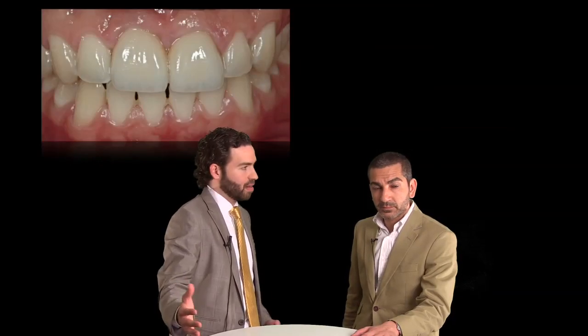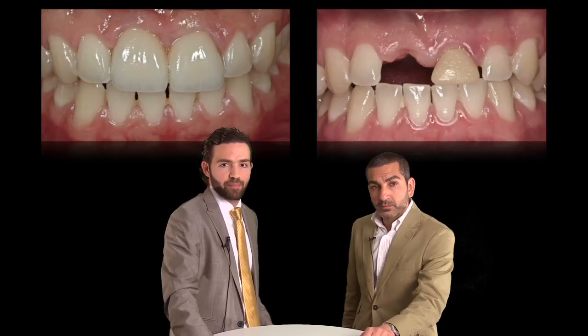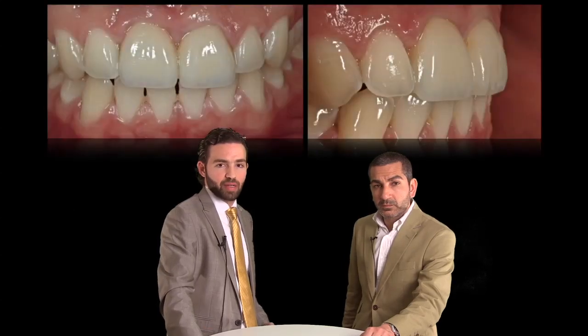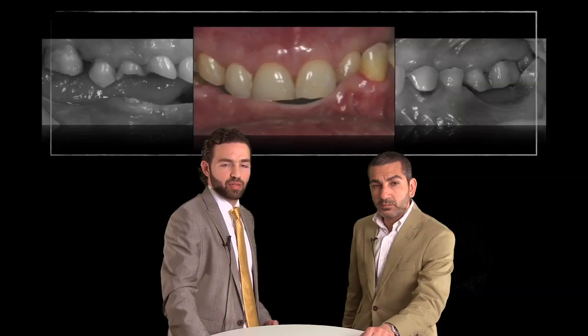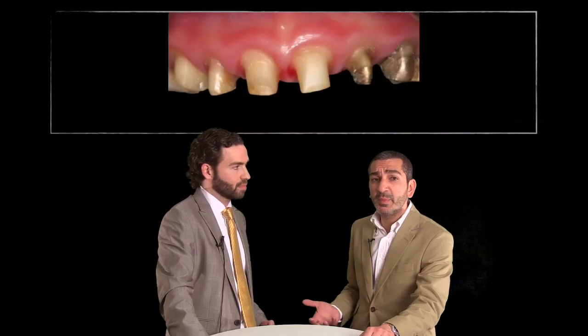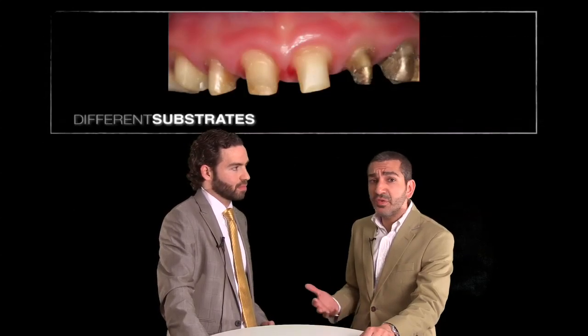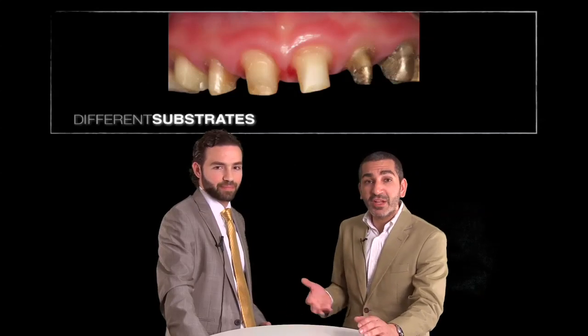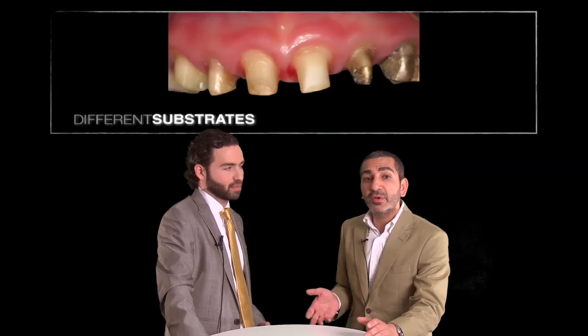Still, porcelain fused to metal crowns are the workhorse in dentistry, and we can get beautiful results with them by proper handling. And we showed you a lot of cases where we can obtain that. The best material to mask in this instance is porcelain fused to metal crowns. We have multiple tools to be prepared, and if we start using translucent material, we may open Aladdin's cave. We're going to get into a lot of trouble trying to match everything. So really, porcelain fused to metal crowns in this instance will make our life a lot easier. Predictable, so we need to be efficient in our dentistry as well as logical in what we do.